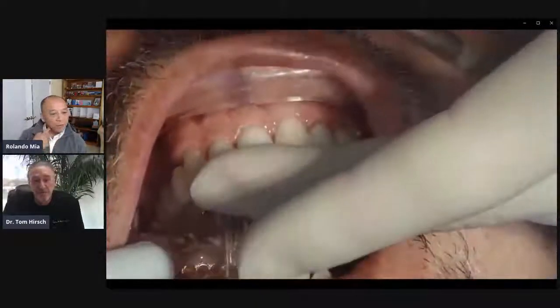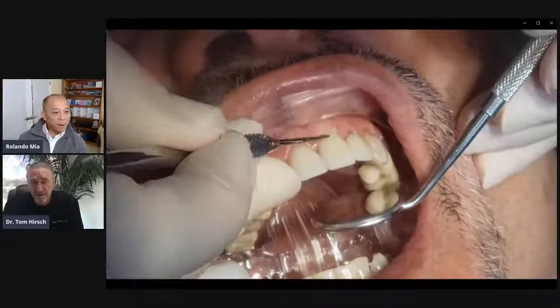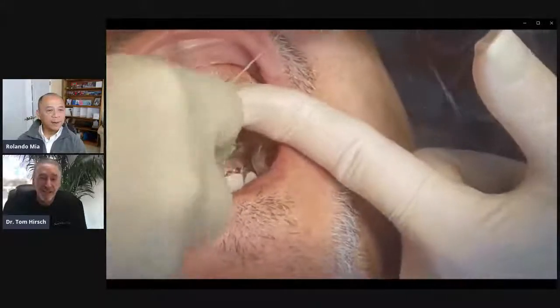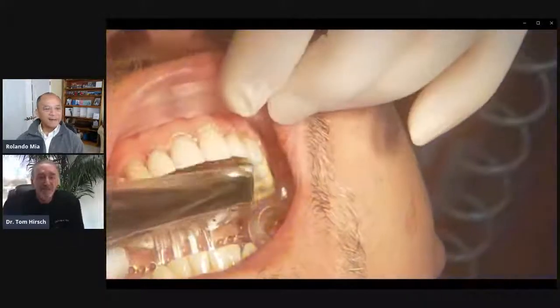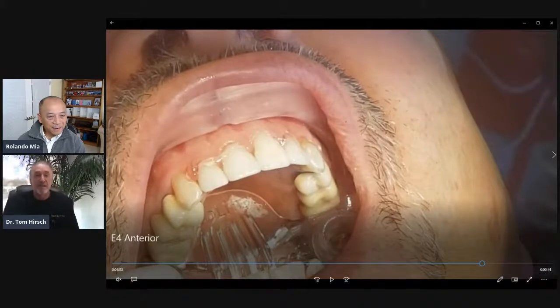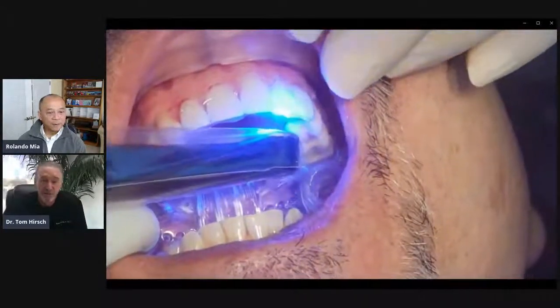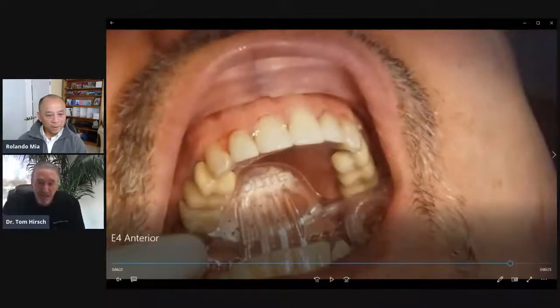You don't have to worry about anything falling down the throat. It looks like the mouth is kept open really nicely, so you don't need a bite block, right? These teeth look a little whiter on the video than in the mouth, but he wanted them a little bit whiter anyway. Your assistant is there with her extra hands — this anterior mouthpiece is like the fifth and sixth hand in the operatory. Make sure you guys put on a glycerin gel for the oxygen inhibitor layer. That's super important so you don't get any staining around your margins. We do it facial and lingually — nothing fancy, just KY jelly. Get it at the pharmacy, cure it. Not once in this entire procedure has my assistant gone in the mouth to evacuate any saliva — it's all just being taken away, which is super.